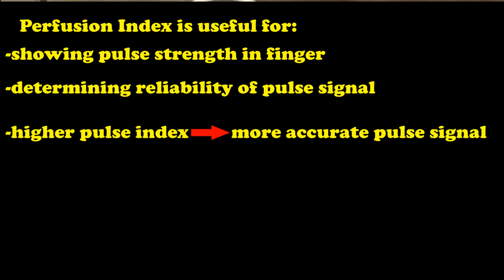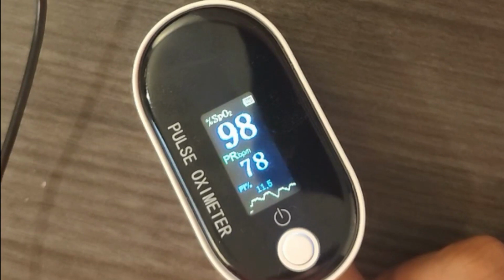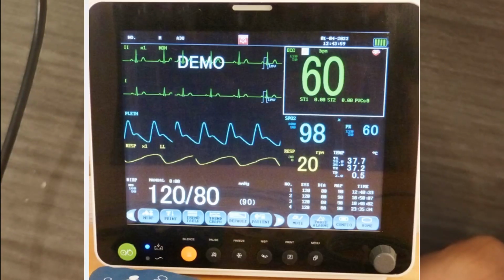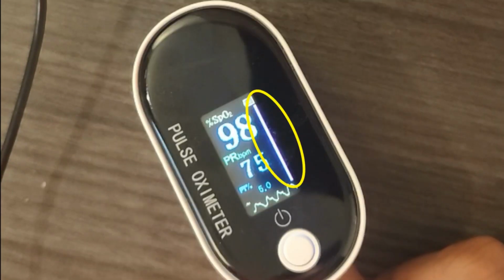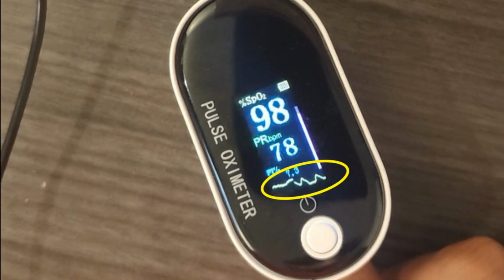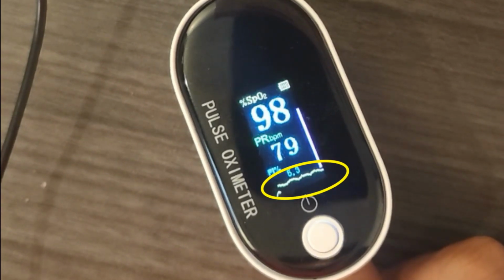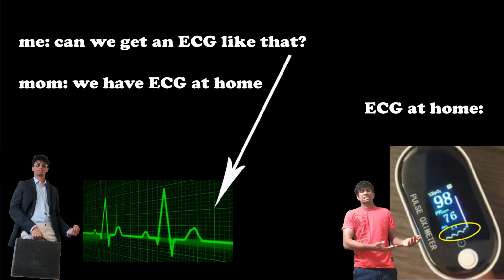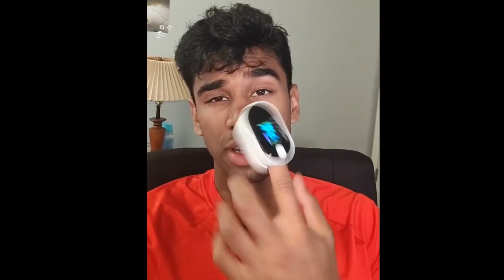And to top it all off, we got some vitals snuck in the right and bottom of the screen, just to give you that hospital vibe. That purple bar over yonder is showing the pulse occurring at a visual rate. And that signal on the very bottom, just under the PI%, is supposed to be like some poor man's ECG, which is used to show the signal of the pulse. But it doesn't really do that, it just seems like it has a mind of its own right here. Right, that's pretty much all there is to interpreting this machine. There's not really much to it.